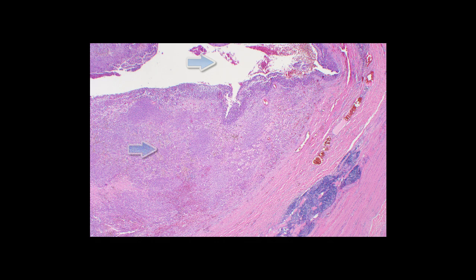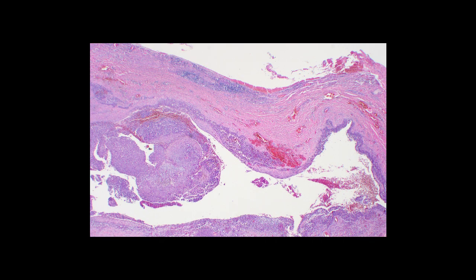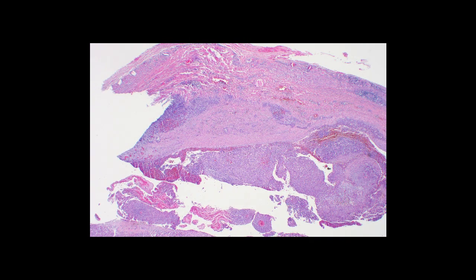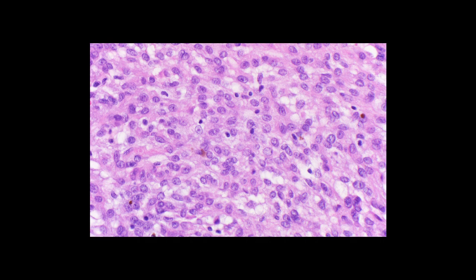Here is another example. Again from low power you can see all three features: the blood-filled space, the sheets of histiocytic tumor cells, and the peripheral lymphocytic cuff and fibrous pseudocapsule. Around the periphery there is a somewhat incomplete lymphocytic cuff in this case, which is a little bit larger than the other example. At high power, again, you can see these oval-round histiocytoid cells that are rather innocuous-appearing, although these are a little bit more plump than the previous examples.